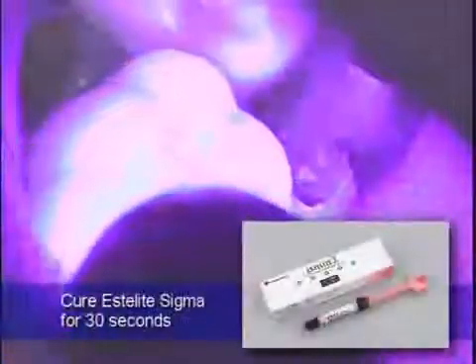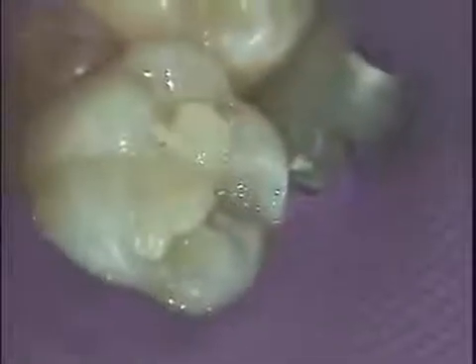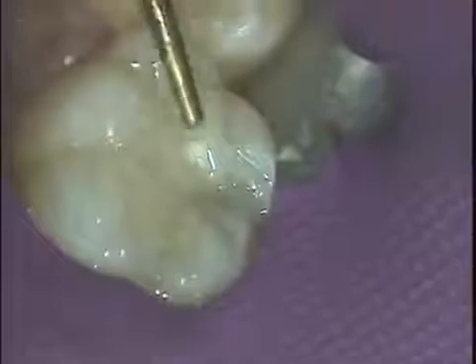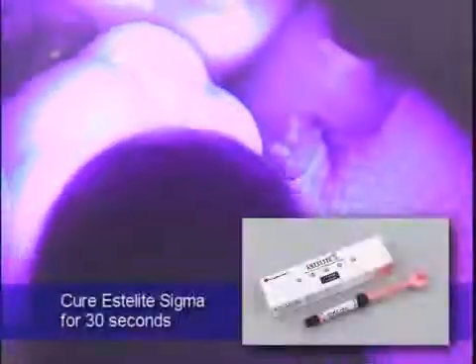Estelite Sigma is cured for 30 seconds. And a final layer is placed in order to assure a good seal and excellent anatomical form. The Estelite Sigma is cured for 30 seconds, followed by finishing and polishing.